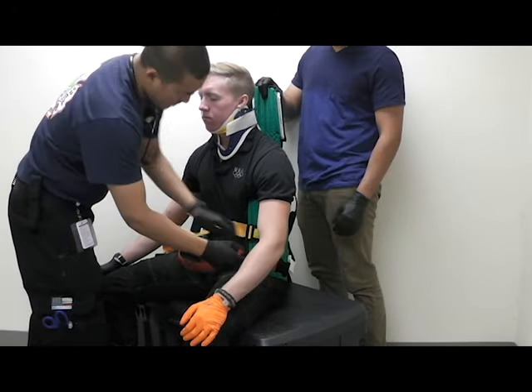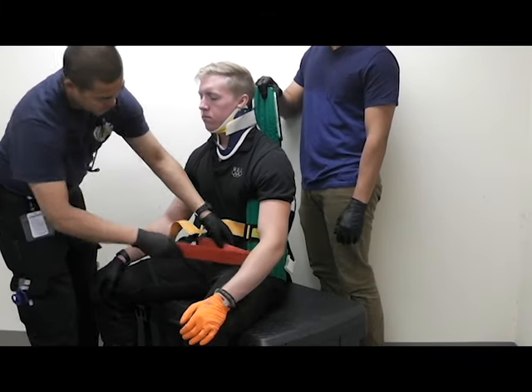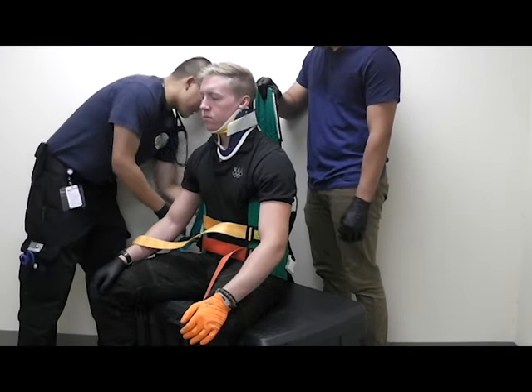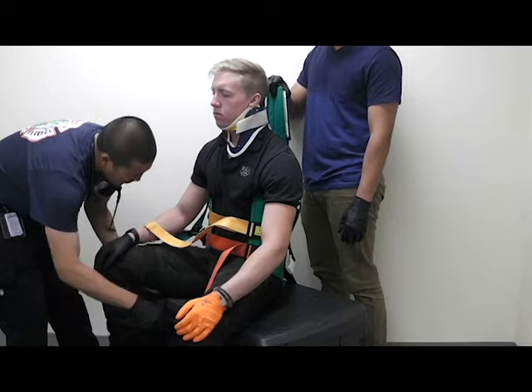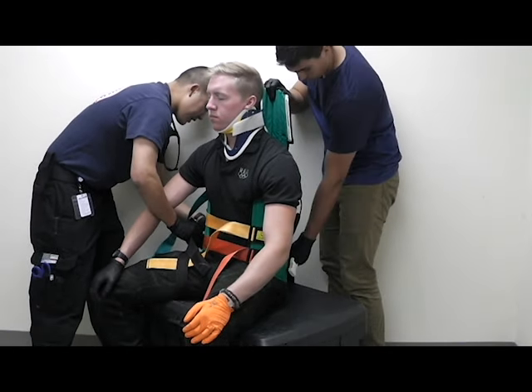Next you're going to go to the bottom. Attach your bottom strap and pull it tight. Then from there you're going to move on to the leg straps. The straps are going to go underneath the leg, pull it through, and then tighten.